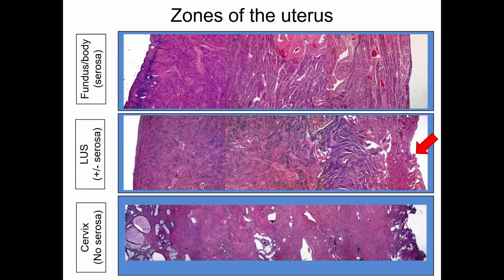As you move up in the uterus, in the lower uterine segment, you start to see hybrid mucosa here with some glands that look like maybe endocervix or lower uterine segment. But back here, the ragged area, the surgical margin is down here, and you can see that we started serosa somewhere in this section. As you move up in the fundus, of course, you have the endometrium, and you have very solid myometrium, and everything is covered by serosa.